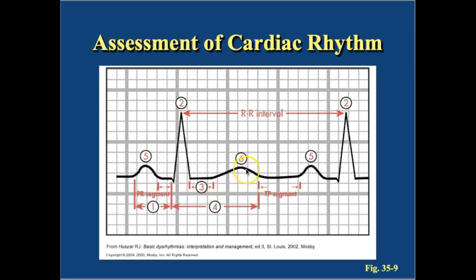The other thing that you'll notice with your T waves is, study your T waves, because these should be upright. They should not be too tall, they should not be peaked.